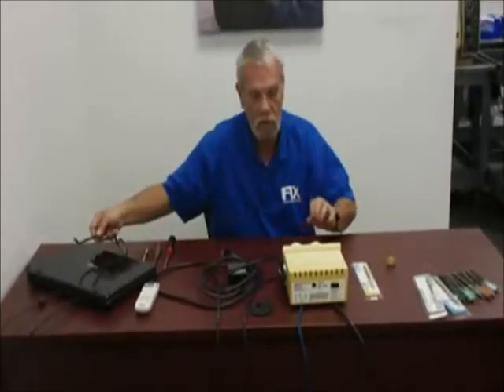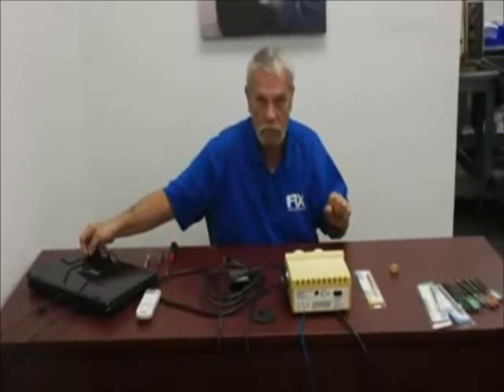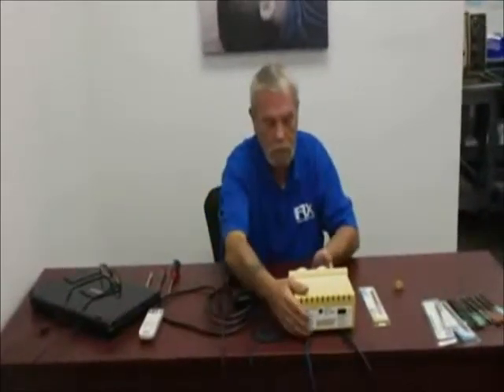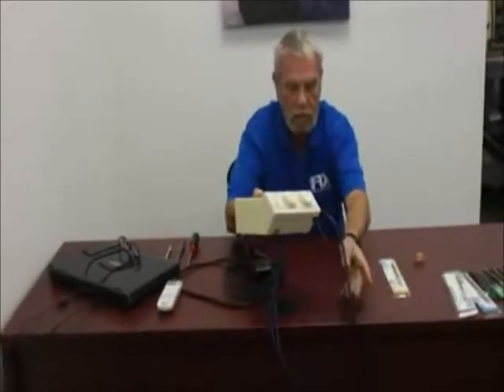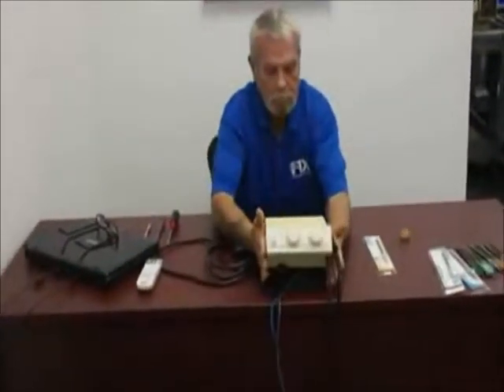We'll explain the differences between ultrasonic scaling and hand scaling in a moment. But first, let's familiarize ourselves with the machine and the components. Our main unit, our base unit, is the cavitron itself.